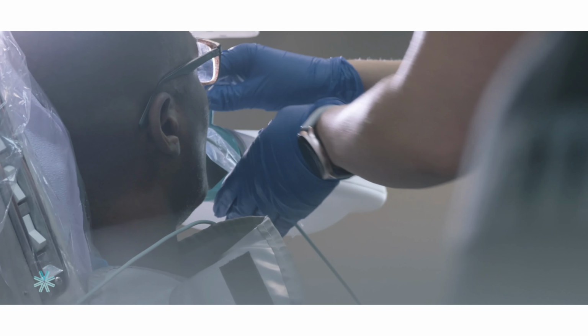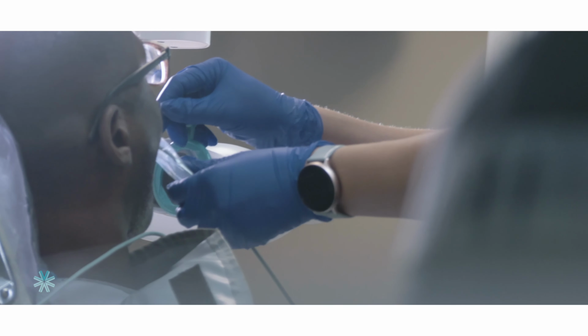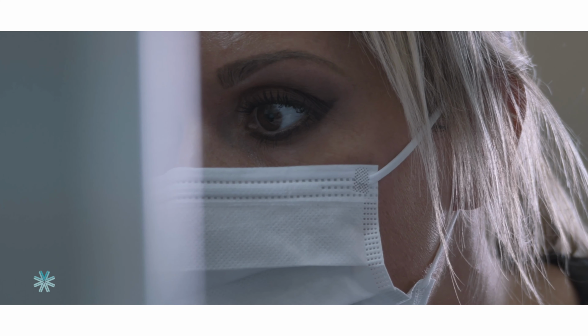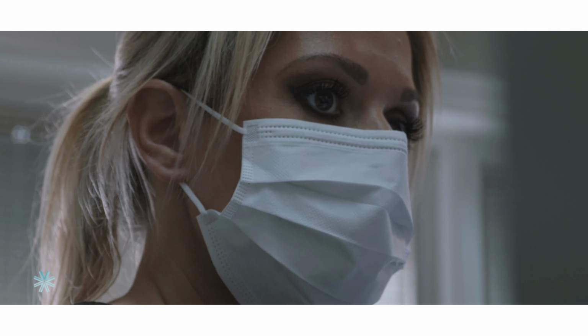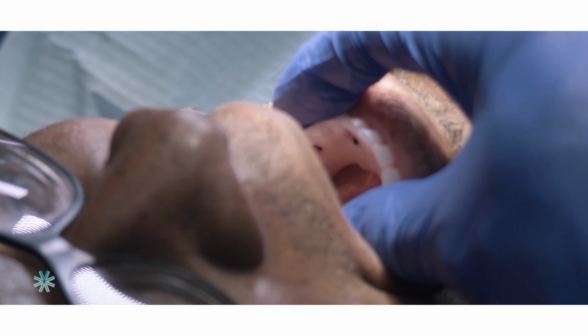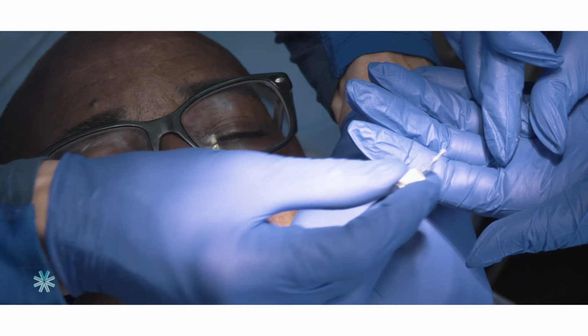Depending on the implant system or the implant placement, we have several different options as far as restorations go. After a doctor places an implant, we design the best possible restoration that not only fills that space, but long-term is going to be in the best interest. So the implant placement is a lot of times paramount.